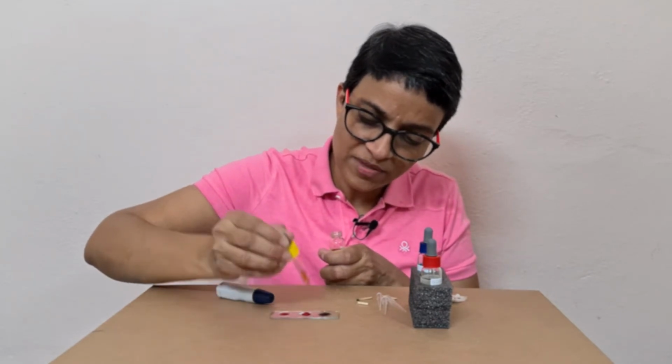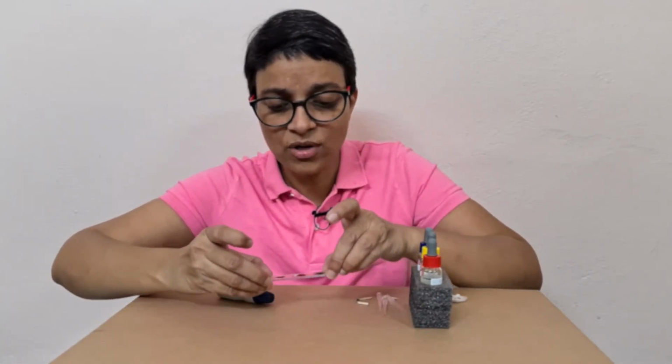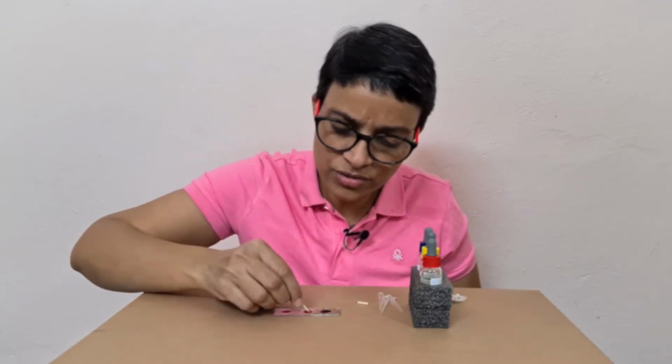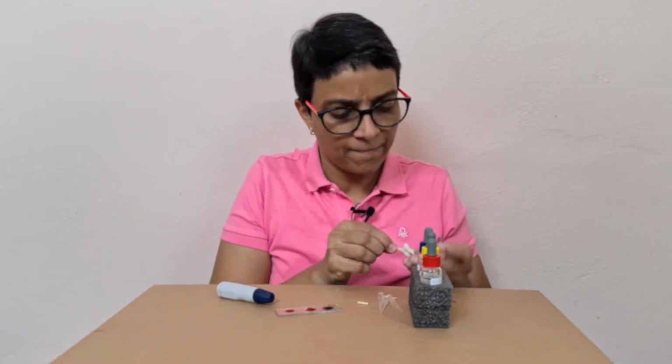This is the only drop that is very stiff and not moving properly. So if you are very doubtful about its movement, and unless you can visualize it clearly, you should not come to a conclusion. Therefore, you can add 1 more drop or repeat the test if you're very doubtful.